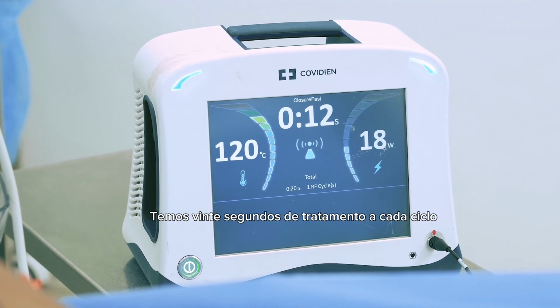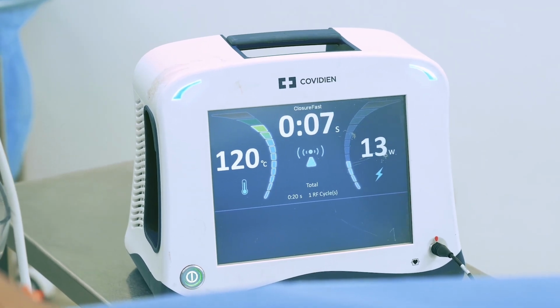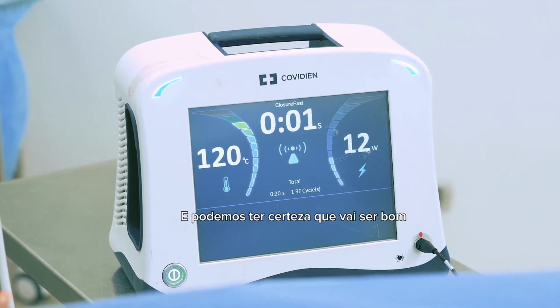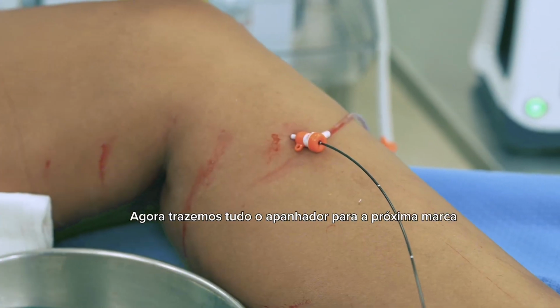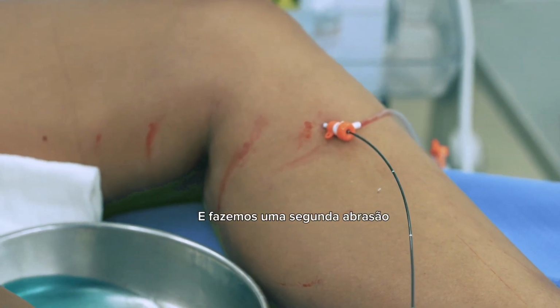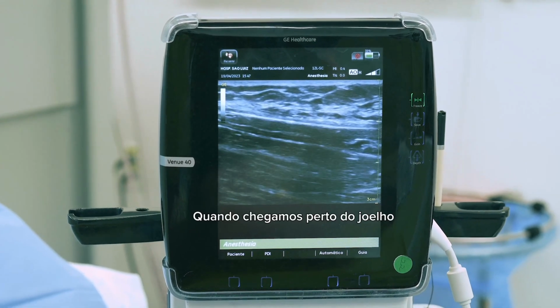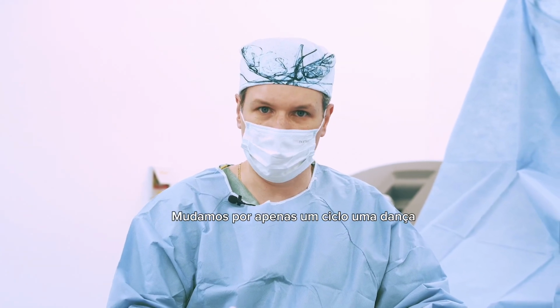We have 20 seconds of treatment each cycle. The energy is related to the temperature, so it is set up automatically, and we can be sure that it's going to be good, you know? Now we bring down the catheter to the next mark, and we do a second ablation. We prefer to do 2 cycles per segment in the thigh. When we come close to the knee, we change to just 1 cycle at the end.